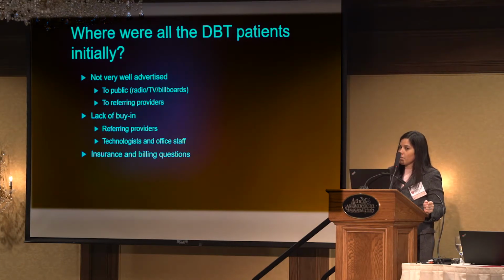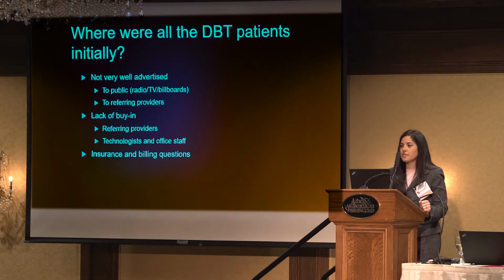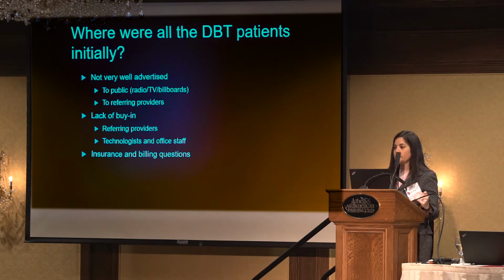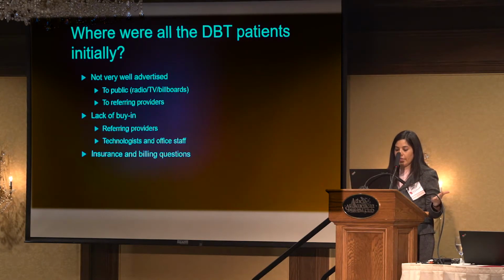Another interesting thing with a meeting with the technologists, we found out that our technologists had some misperceptions about tomosynthesis and were telling patients, oh, you have fatty enough breasts, you don't need tomosynthesis. So really educating everybody, your technologists, your schedulers, when the patient calls and asks a question about the tomosynthesis exam, making sure everybody who's going to talk to the patient understands the radiologist's perspective and is able to present the information that should be presented to the patient.